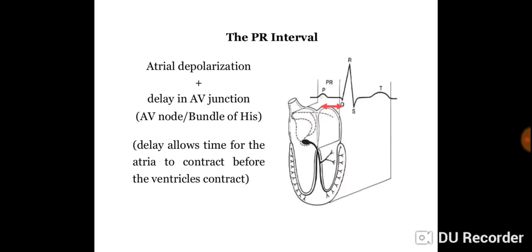Now, what is the PR interval? This is the P wave. We'll get to it later. All these waves, most of them are P, Q, R, S, T. This is alphabetical. You've got a U around here. We'll mention that later. These are in alphabetical order.